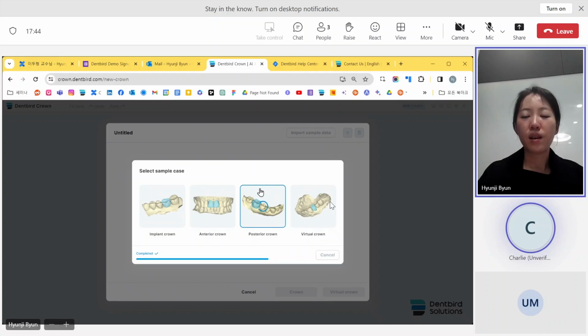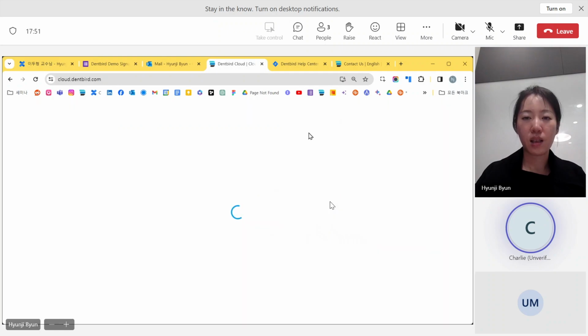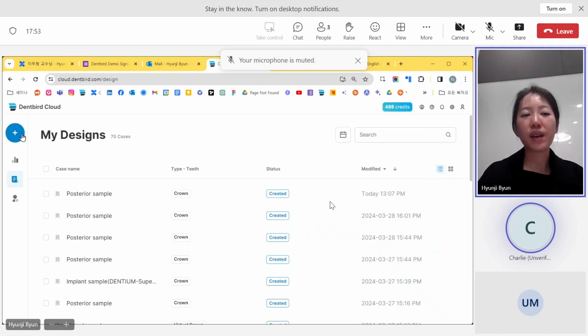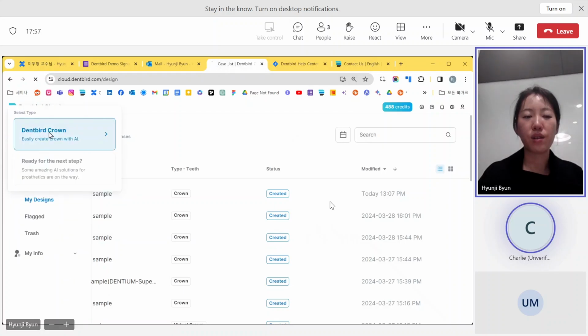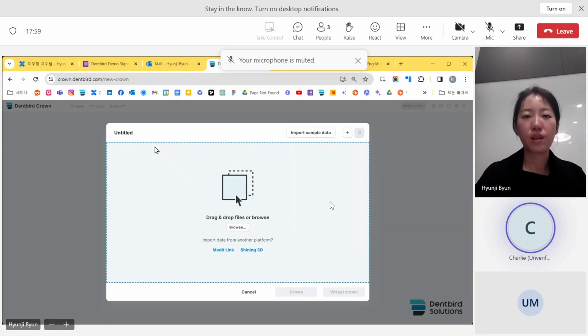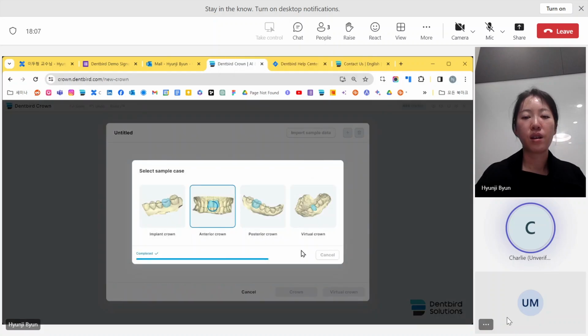I see. So you don't have a milling machine. No, we don't have a milling machine yet. Sorry, what kind of CAD do you use? I do see a lot of people use it. We don't use any CAD. We don't have any CAD software, because we are more like just doing the printing, but now we want to do the design ourselves.